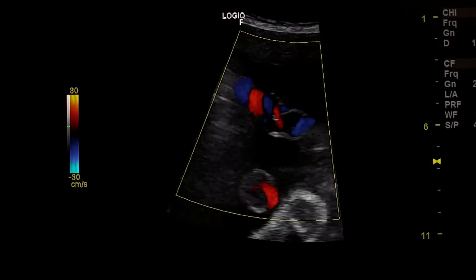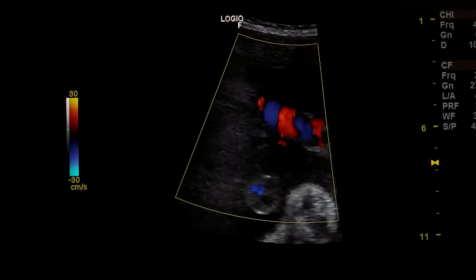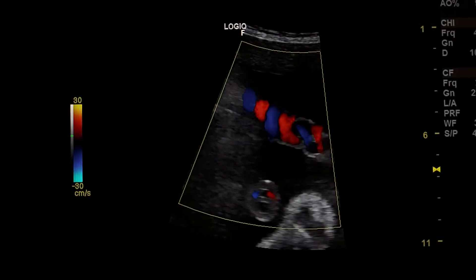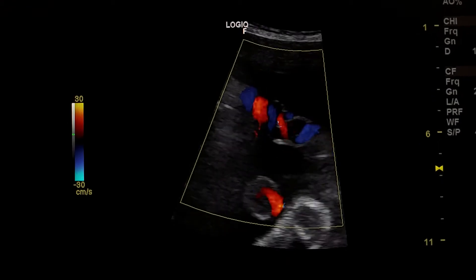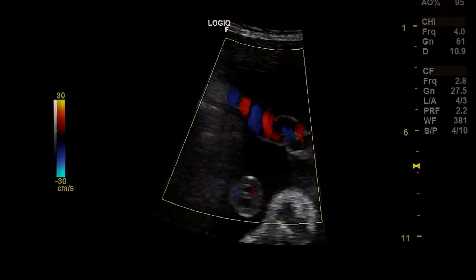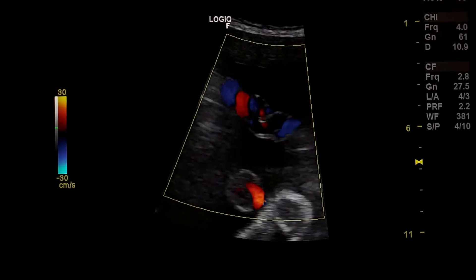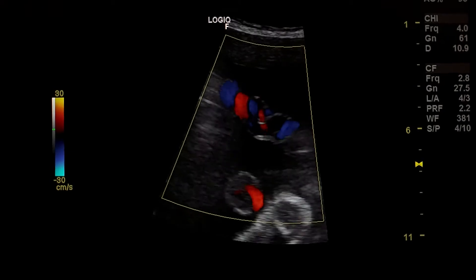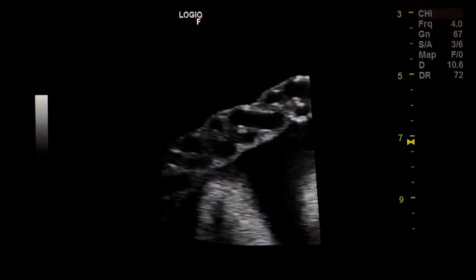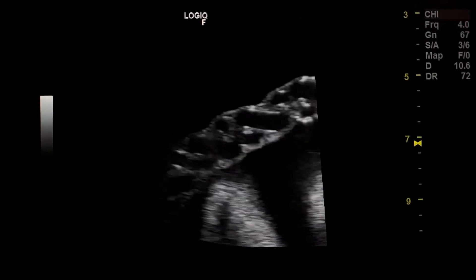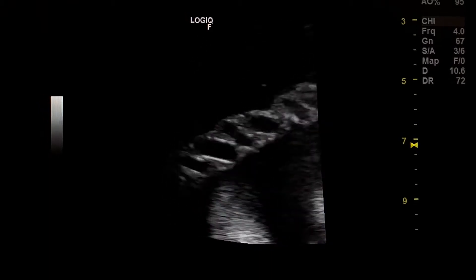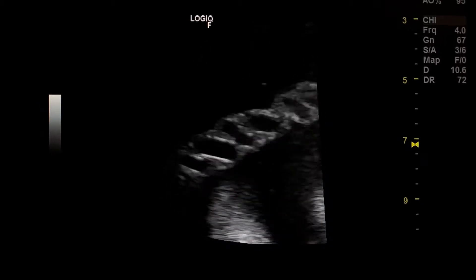Here we see that the single umbilical artery is associated with two anomalies: first, esophageal atresia, as we don't see the stomach; and also with congenital heart anomaly. So when we see a single umbilical artery, we should scrutinize for fetal anomalies.